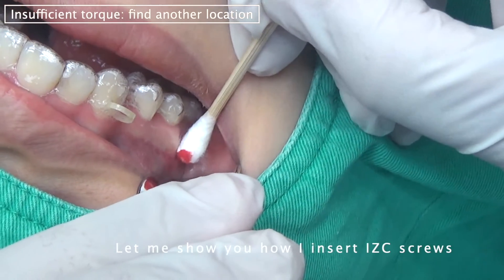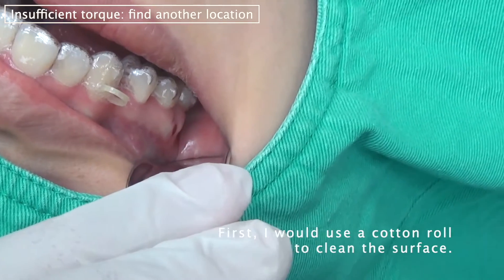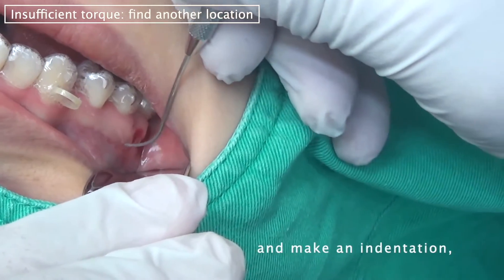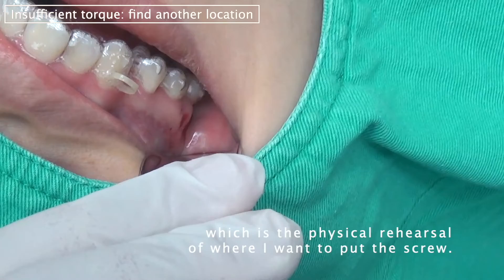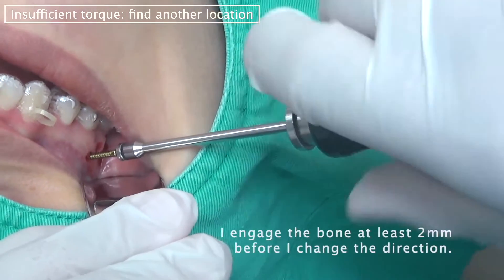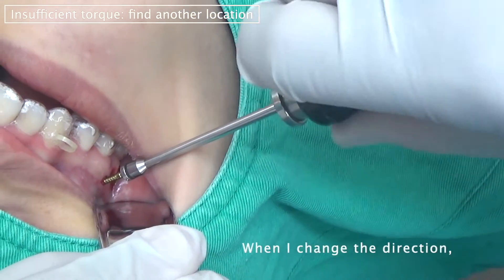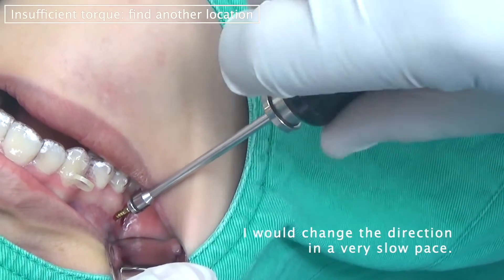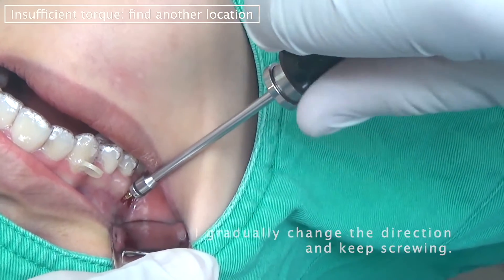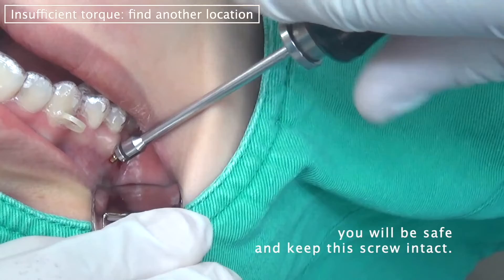Let me show you how I put the IZC screw without fracturing it. First, I use cotton to clean the surface, and I use an explorer to find a spot and make an indentation, which is a physical rehearsal for where I want to put the screw. I follow that indentation and engage the bone at least 2 millimeters before I change the direction. When I change the direction, I do it in a very slow pace — gradually change the direction and keep screwing. If you follow this tip, it will be safe to keep the screw intact.